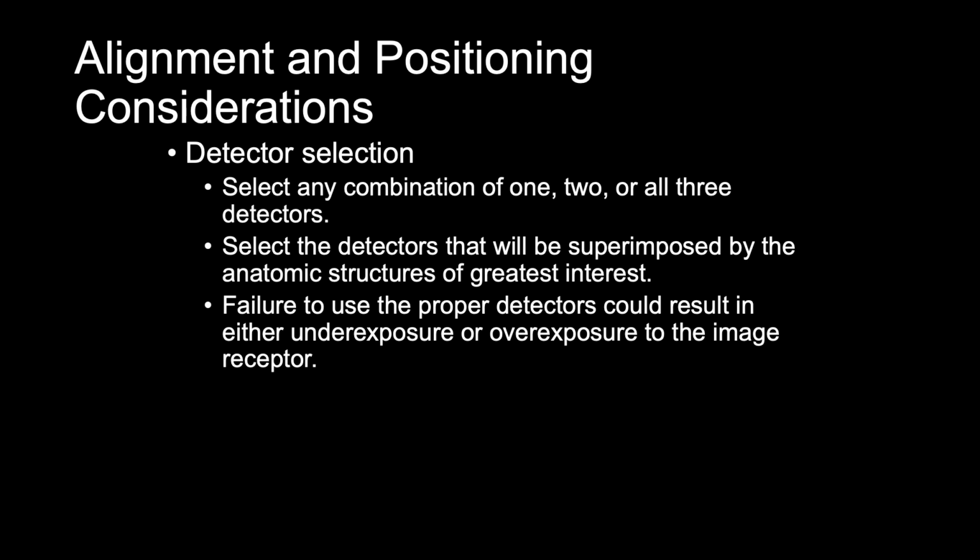Selection of the detector or detectors to be used for a specific exam is critical when you're using the AEC system. AEC systems with multiple detectors typically allow us to select any combination of 1, 2, or 3 detectors. Radiographic equipment can also be purchased with 5 AEC detectors, which provides greater flexibility in imaging a wide variety of patients. The selected detectors actively measure radiation during the exposure, and the electrical signals are averaged.